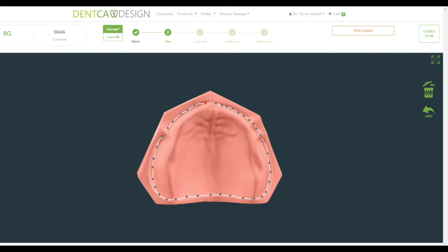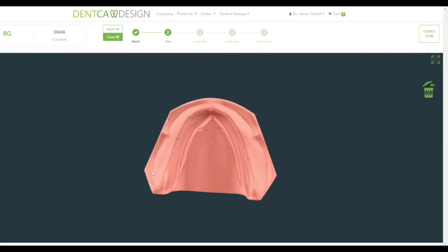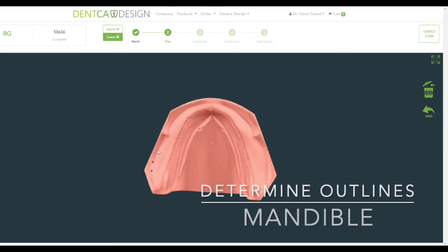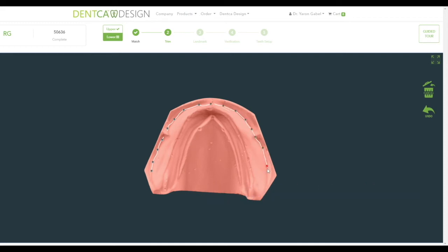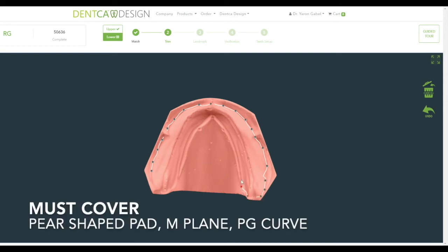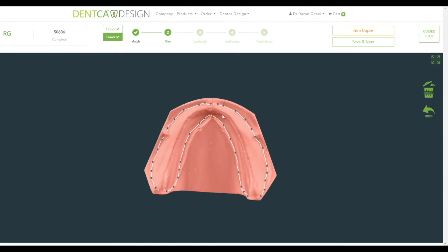Once the upper trimming is done, a checkmark should appear next to the word Upper on the top panel. Click the lower button under it and continue to trim the mandibular arch. Please note that if doing a single arch, it is still necessary to trim the opposing dentition model, especially in the case of the lower arch. This must be done so the Denka Design software can automatically arrange the teeth. Once the upper and lower trims are completed, click Done to continue, then click Save and Next to begin the next step.